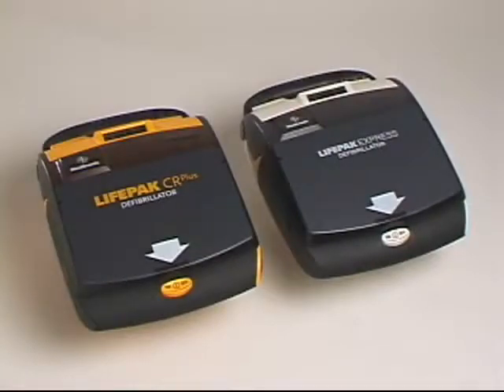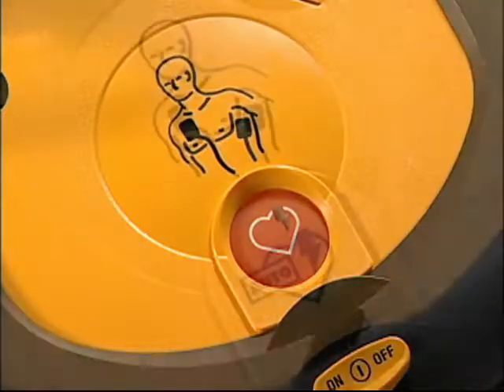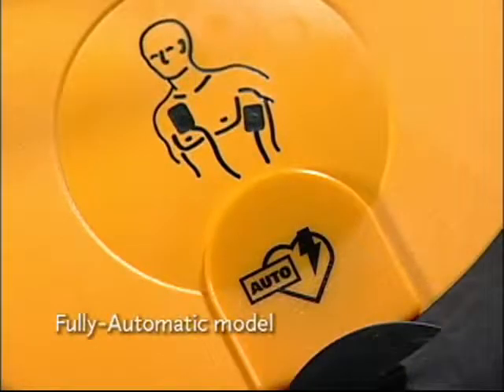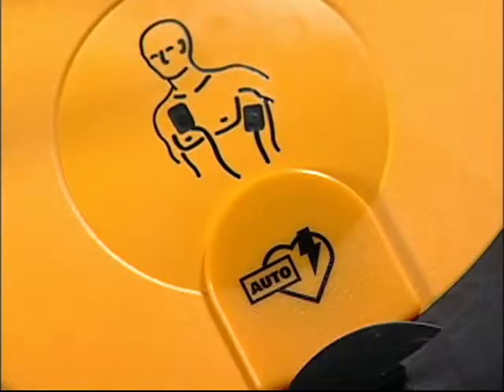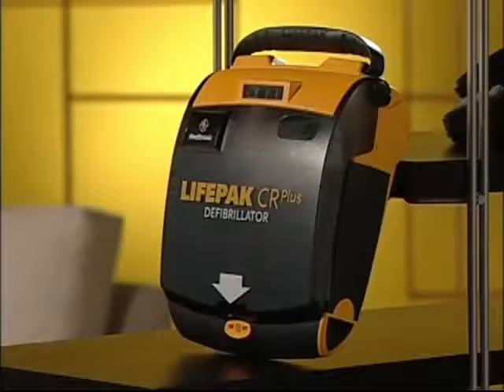This video covers the operation of two Lifepak AEDs, the Lifepak CR Plus and Lifepak Express defibrillators. The semi-automatic model has a shock button that you press when instructed by the AED. The fully automatic model does not have a shock button and delivers the shock automatically. Because the operation of these AEDs is so similar, we'll use only the Lifepak CR Plus AED in this video.